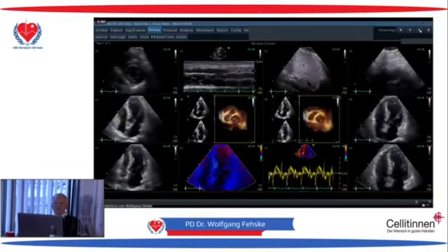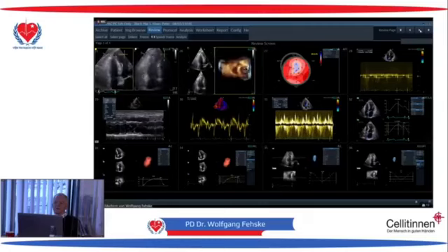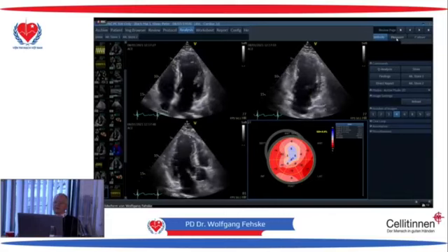So I have done all what you expect one could do from a patient. And first of all, I did this here. I did the AFI.